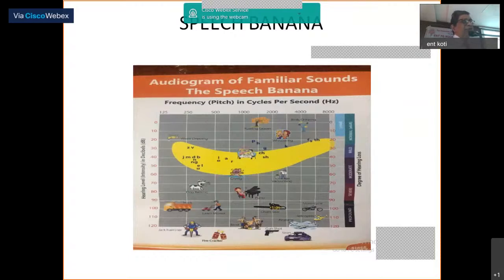And if you go to 256, don't say vibrations. The moment you say vibrations, the patient is catching that vibration. Vibration is a sense which is felt. Sound is a sense which is heard. So many times nowadays I find people, particularly from IT, when I do a Rinne test and keep the fork here, I ask, are you hearing sound? They say vibration, vibration.